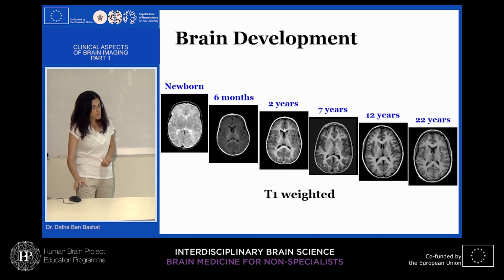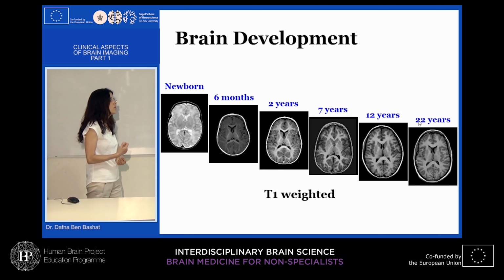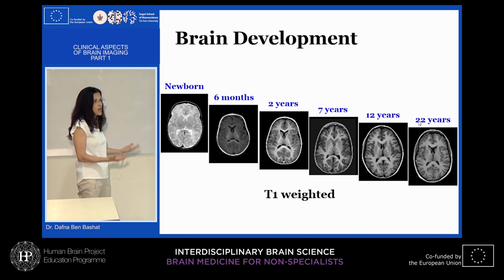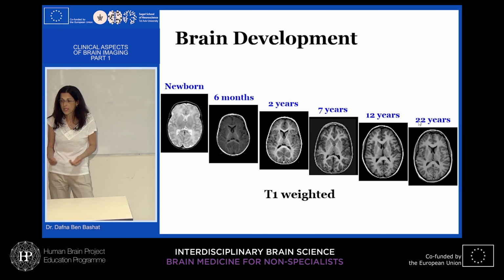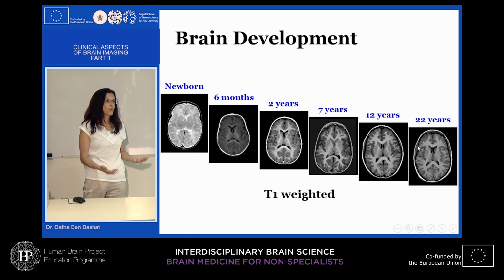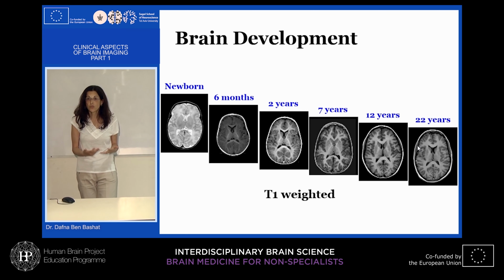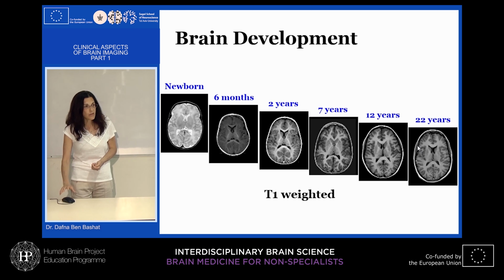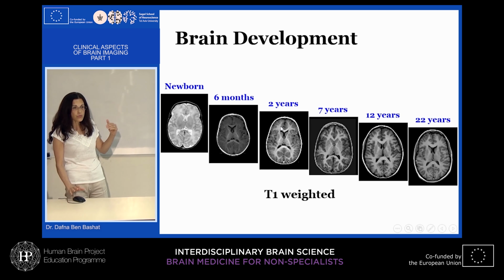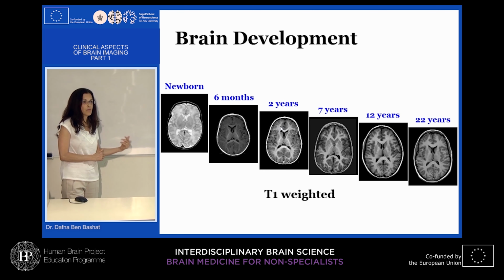What is the limitation of this method? The contrast of the brain of a 2-year-old child, a 22-year-old and a 40-year-old are the same. We do know there are a lot of processes and maturation of the brain, more myelin and more synapses, but the contrast doesn't change. A lot of children come around age 4 or 5, sent for MRI for developmental disorders. We look at the brain and it looks fine. If there is any abnormality and after 2 years it doesn't really develop, we won't be able to see it, because the method is not sensitive on a normal-looking brain.